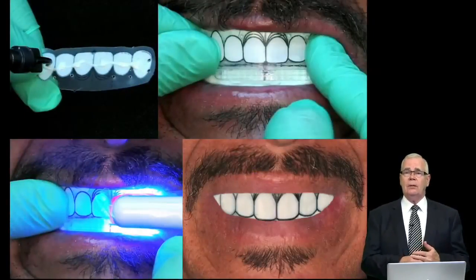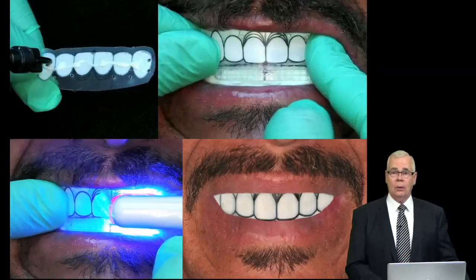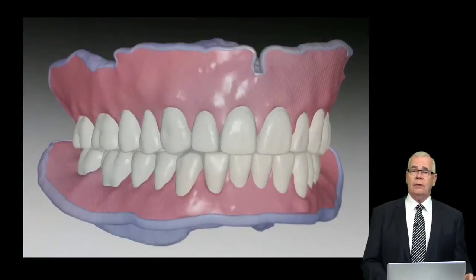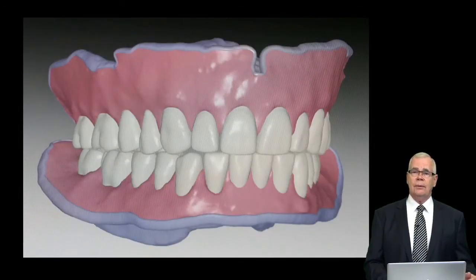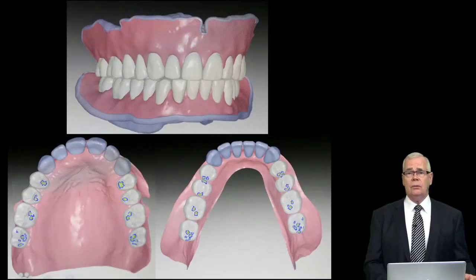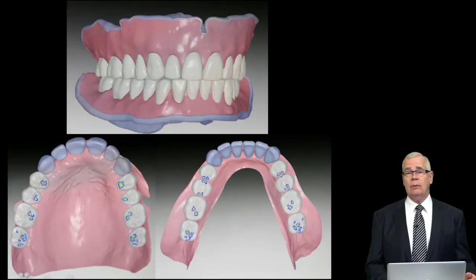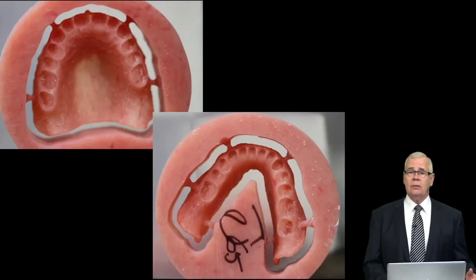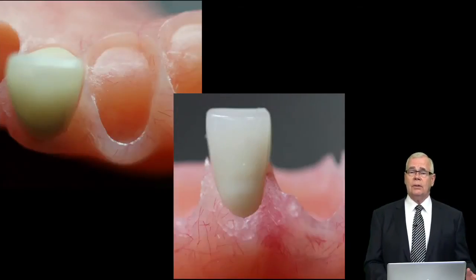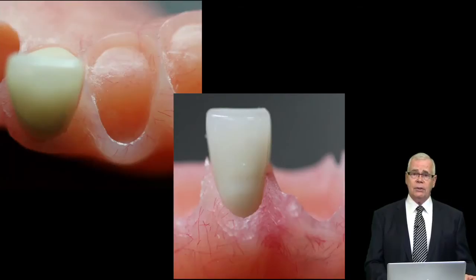We'll actually affix a template to the lip support flange and light polymerize it in position, and then we can do a wax trial placement all in one appointment. After everything is scanned, the teeth are set in the computer, the base is formed, the occlusion adjusted to what we've specified, and the type of occlusal scheme that we would like to produce.